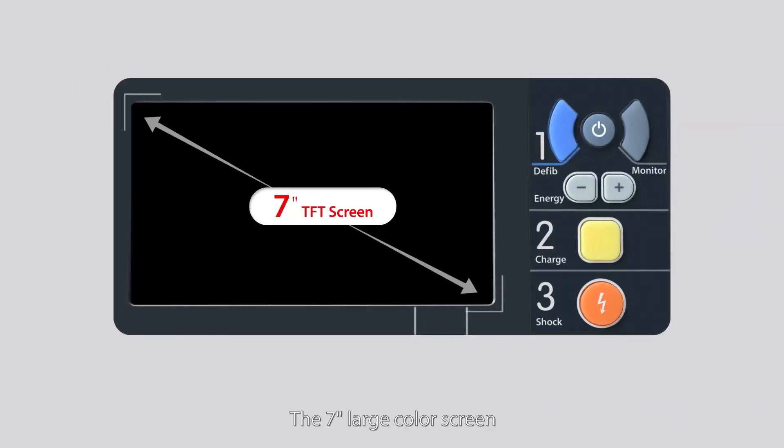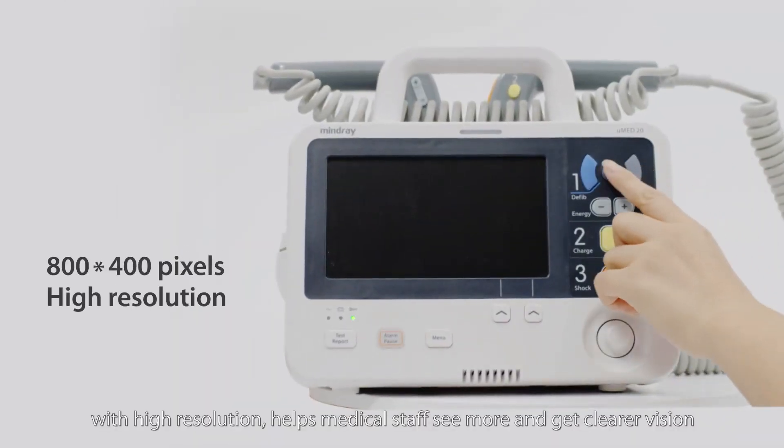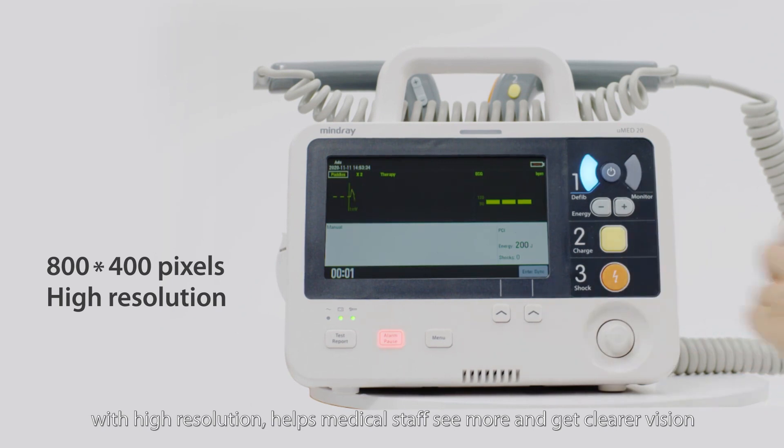The 7-inch large color screen with high resolution helps medical staff see more and get clearer vision.